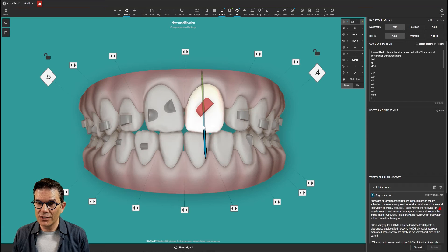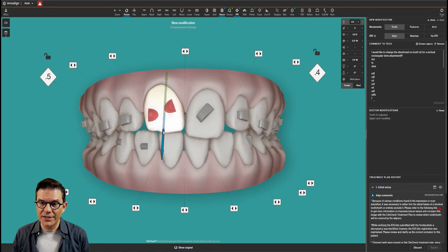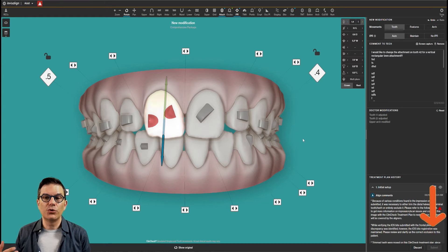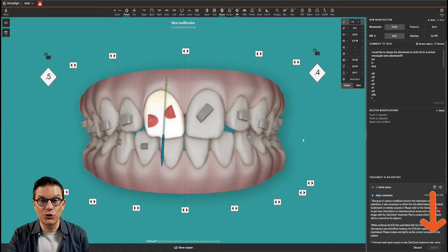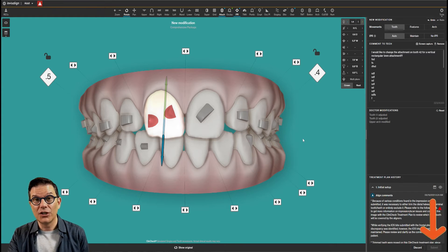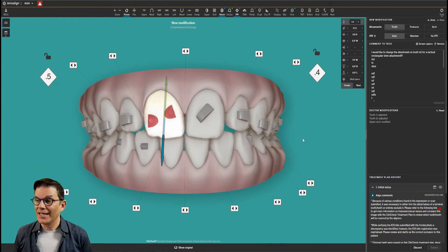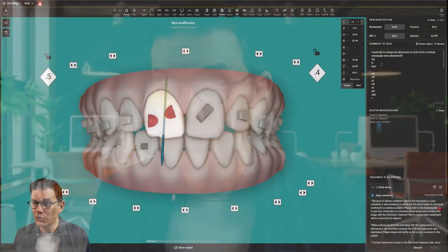Once you've done your modification, you can submit the case to the technician. When you submit, it sends this new modification that you did to the technicians at Align, and this is what they would use to build your new ClinCheck treatment plan. When you're doing your modifications, it doesn't mean that you cannot put any comments — it's a combination. So if you want to add comments to explain what you did, you can do it.